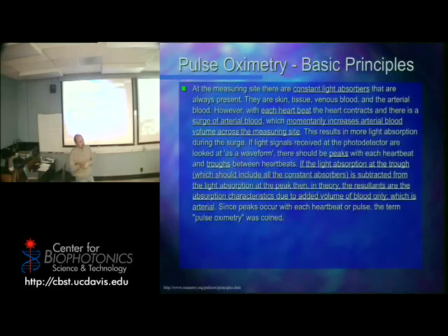Well, what I can tell you is the result of it dropped the malpractice insurance for anesthesiologists in half. Okay? So those of you that want to be anesthesiologists, this made a big dent. The reason for that was because it was really hard to detect low oxygenation in patients on the operating table. The way they would detect it is the nurse or the doctor saying, oh my gosh, the patient's blue. This is a problem. The patient has lost color in their face and tissues. That can be too late because that usually means you're down somewhere in the low 90s, okay, or even below 90, and that can be a problem.